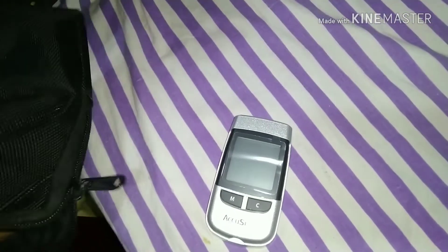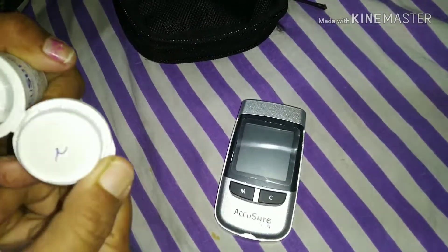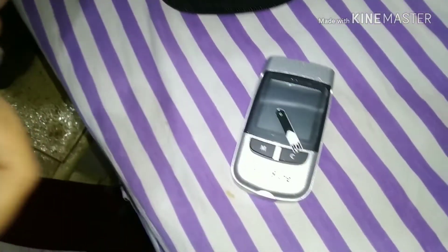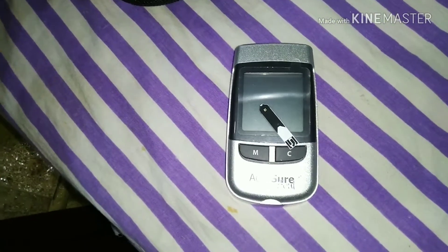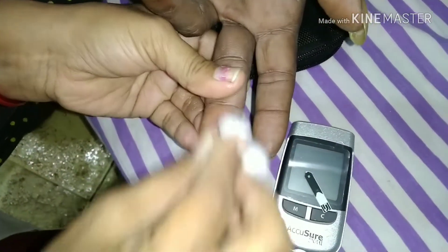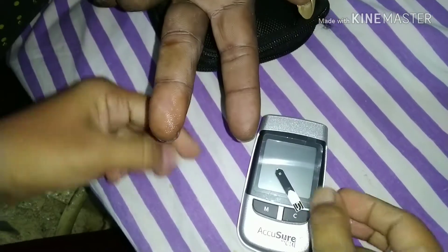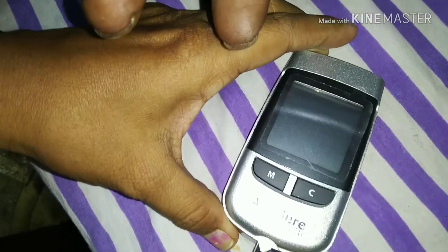Now we'll see how it will be done, so prepare all the things. First of all, get ready all the things and sterilize with a sterile rub. Then insert the strip part into the machine.